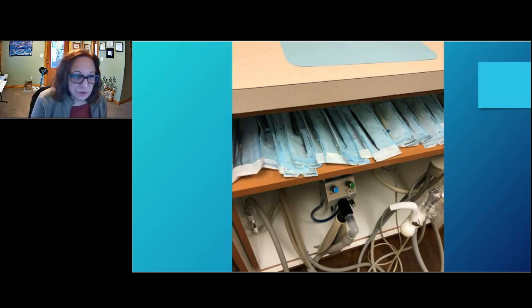I did mention that sterile storage items should be in closed doors, drawers, something that protects them. Even if you have nothing else, put it in a bin with a lid. That's better than what you see here. This was in a practice, actually behind the dental chair. As you can see, these items were left out. This was permanent storage for this practice. So these items were there, patient after patient after patient, potentially the outside becoming contaminated. If the paper side were to become contaminated, it would go through to the instrument.